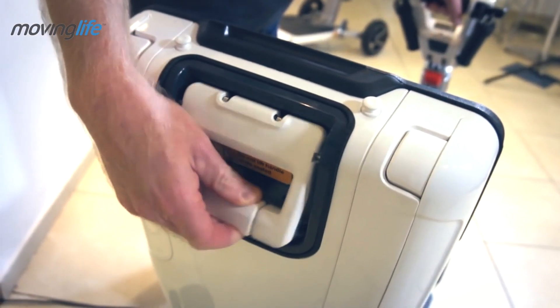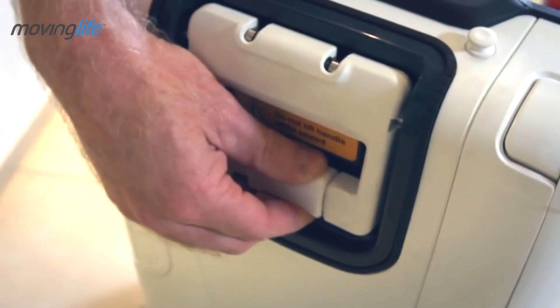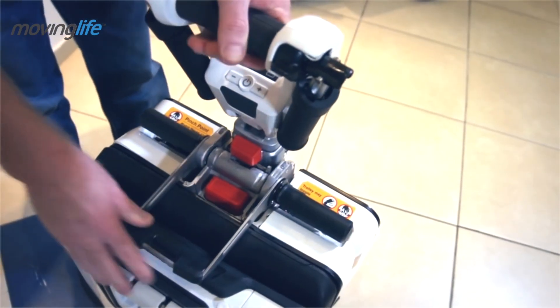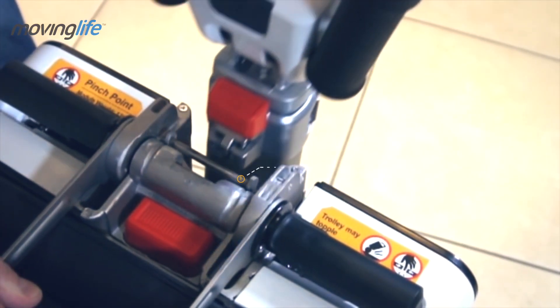To lower the seat, release the secure lever of the back handle and bring the handle to a 90 degree position. When engaging the tiller with the chassis, make sure the lock under the small red button is parallel to the engagement pivot.